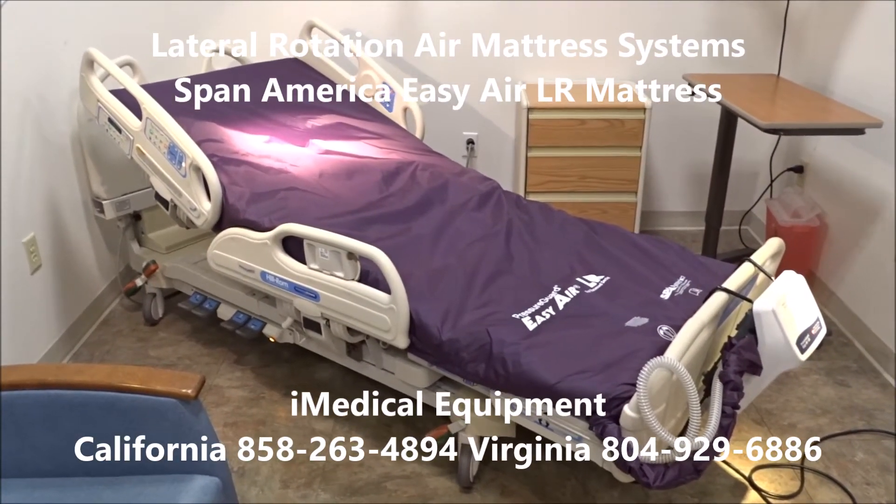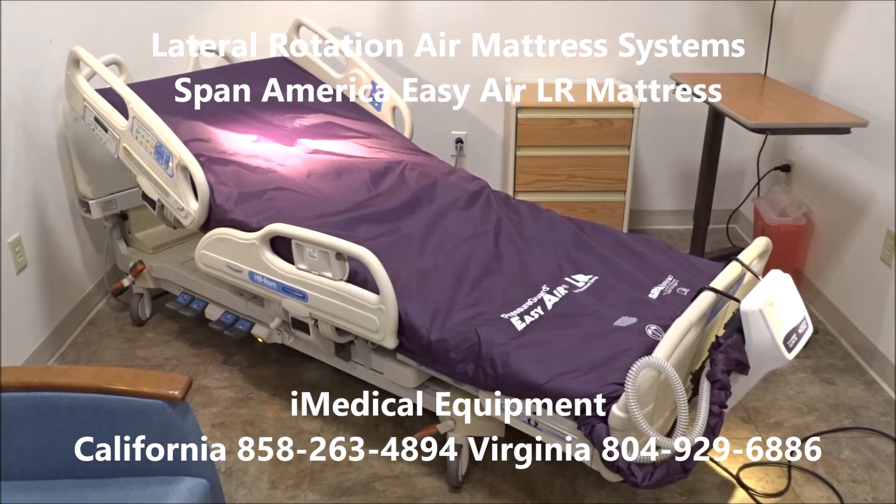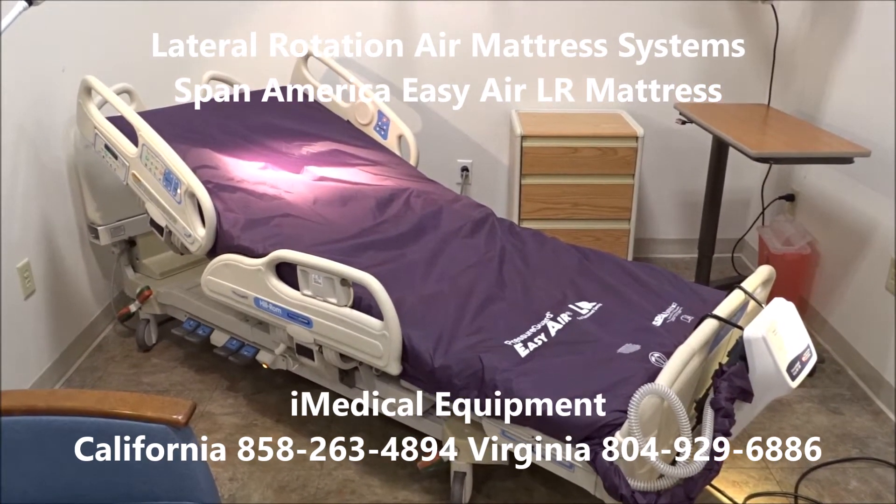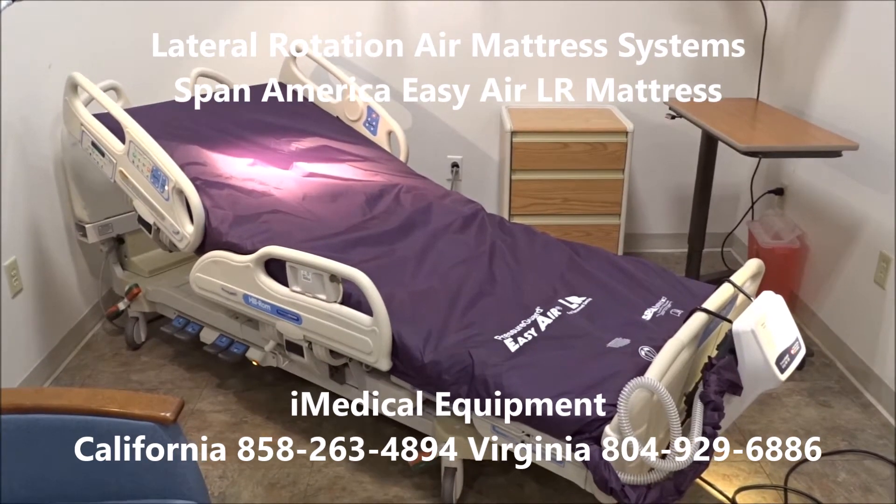We're at iMedical Equipment and Service, looking at bed systems with air mattresses used to treat and prevent bed sores, pressure wounds — basically wound care type therapy.